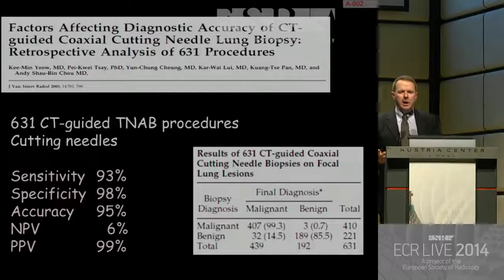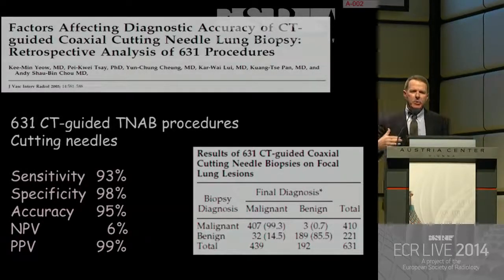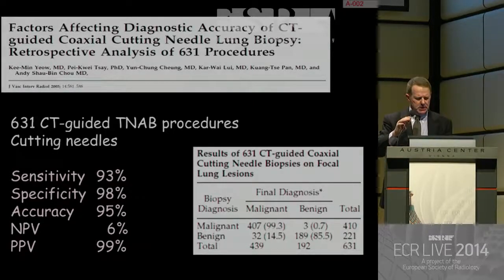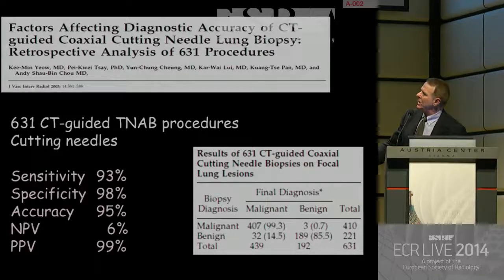How good are we if we are able to follow all these advices that I'm giving you? Well, we should be very good. I brought you a couple of reviews. This is about 631 needles. And you see that altogether, in this literature review of this group, the accuracy was 95%.